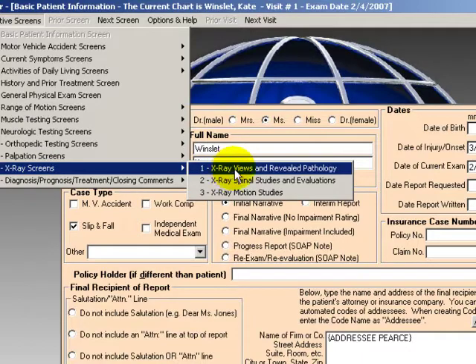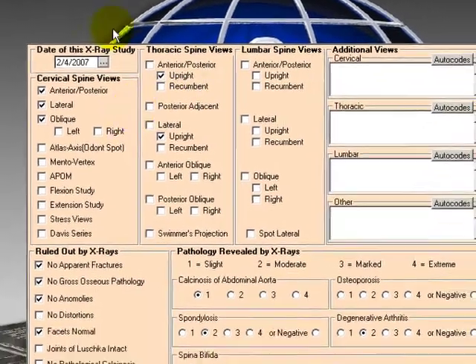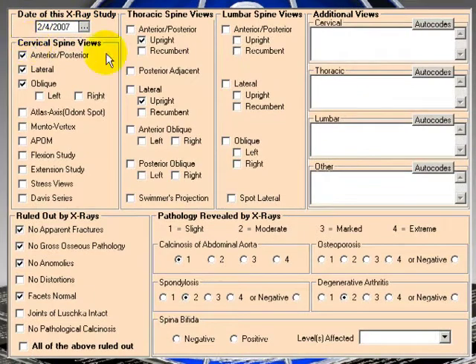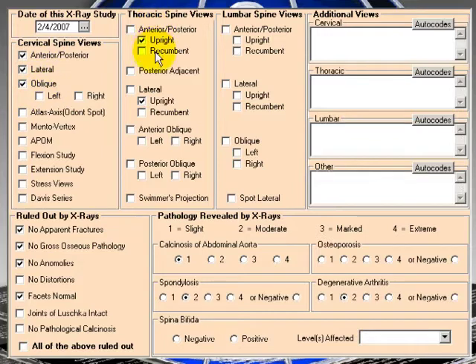So here we have the date of the x-ray, what views. Here are cervical views, anterior, posterior, lateral, oblique. What do we have checked off here?